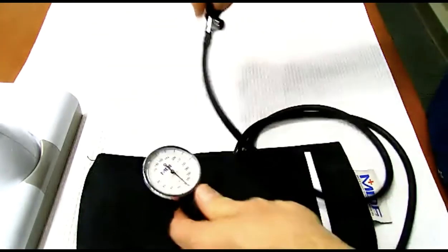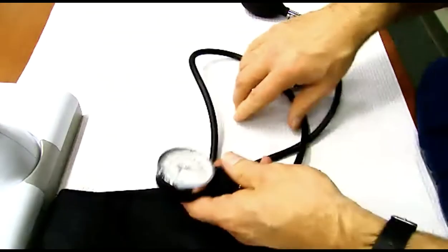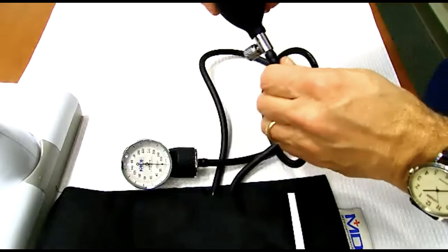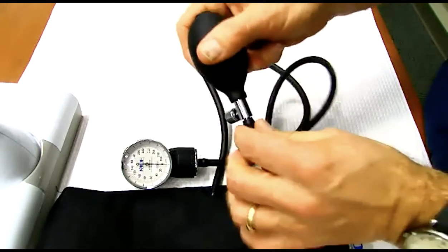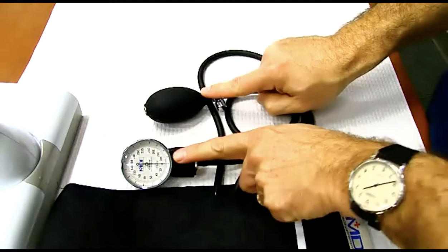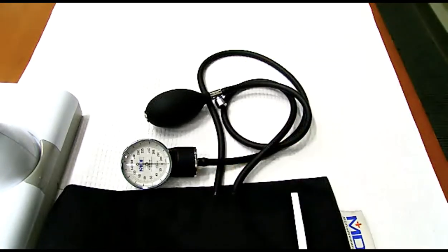So let's forcefully push. I have the bulb valve on the hose closest to the end and then the manometer, but it really does not matter. We've got the tubing connected to the manometer, and we need to have tubing connected to the bulb valve. Push that on, and once you've pushed it on as far as you can, have your partner help you because they're maybe stronger than you are. I'm going to have the instructors walk around and I'll come out there for a second. I want to make sure everyone has attached the bulb valve and the manometer to the hosing connected to the blood pressure cuff. All right, so we have assembled everything.